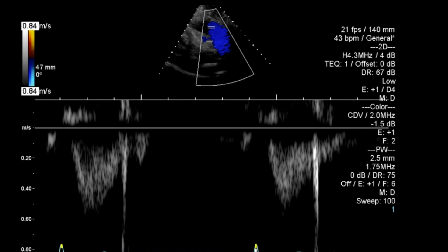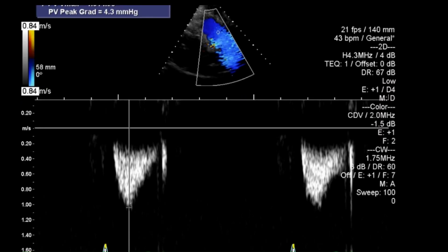And then looking at a pulse wave Doppler and a continuous wave Doppler through the pulmonary valve.